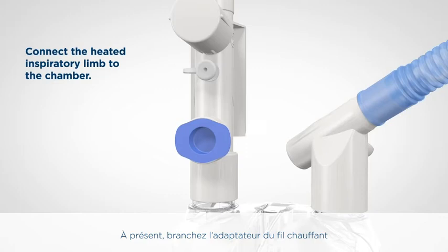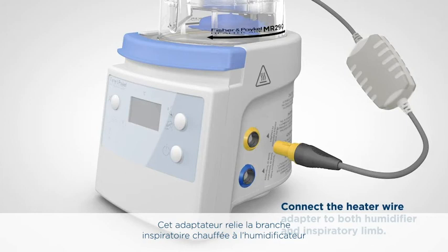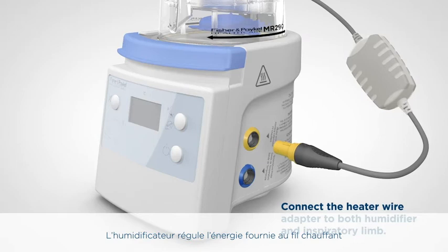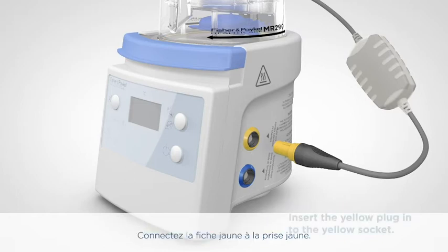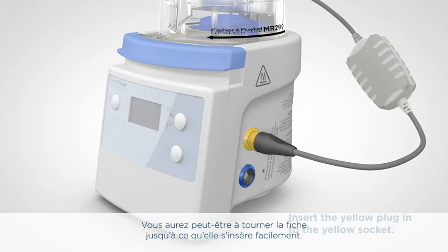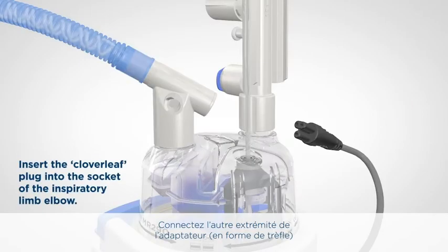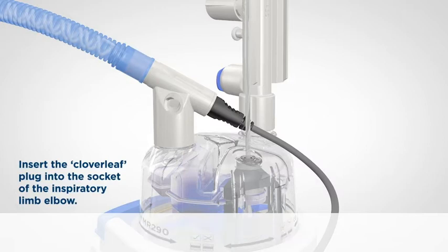Connect the white elbow-shaped connector of the blue corrugated inspiratory limb to the other port on the humidification chamber. Now let's connect the heater wire adapter. This adapter connects the heated inspiratory limb to the humidifier and provides energy to power the wire in the limb. The humidifier adjusts the energy delivered to the wire to maintain humidity and reduce condensate in the inspiratory limb. Connect the yellow plug to the yellow socket — the socket is both colour-coded and keyed to the plug. You may have to turn the plug until it slides in easily; it should click into place. Connect the other end of the adapter, shaped like a cloverleaf, to the white socket at the back of the elbow connector on the inspiratory limb. Be careful to line the plug and socket up to avoid damage to the breathing circuit or adapter.